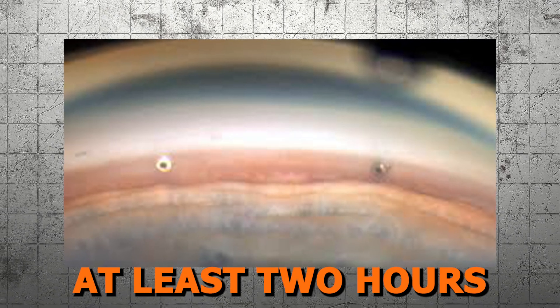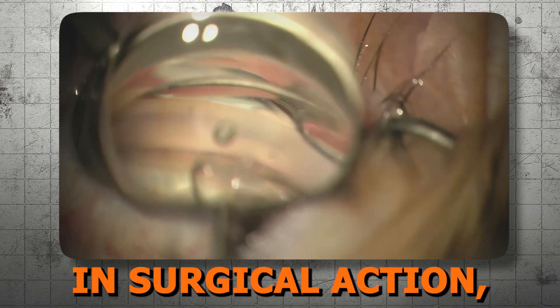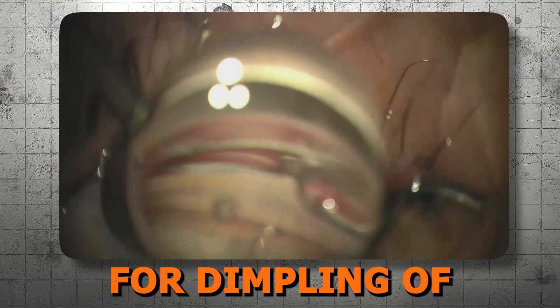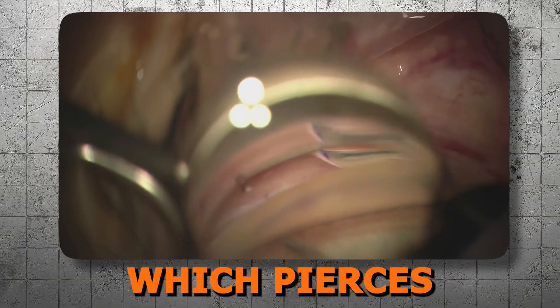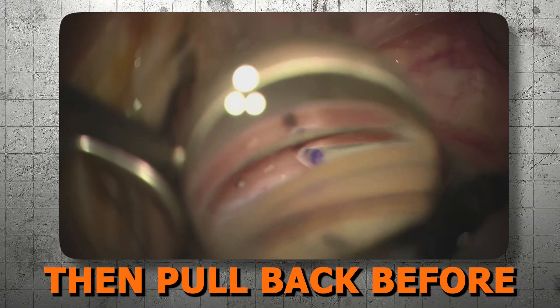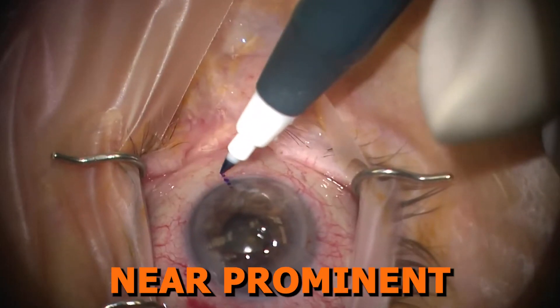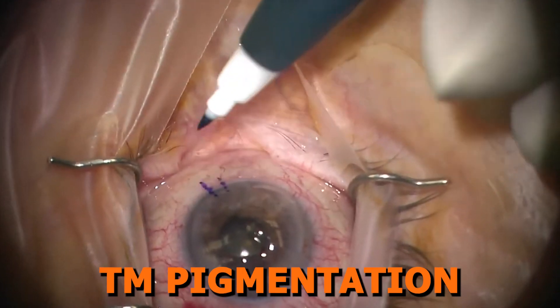With 2 stents in each inserter, placement at least 2 clock hours apart increases access to more collector channels. Here is the iStent Inject W in surgical action, where there is alignment of the trocar to the central TM, then a forward dimpling of the tip, followed by pressing the inserter button to release the device, which pierces through the TM into Schlemm's canal and is seated, then pull back before releasing the inserter button. In order to maximize the chance of outflow, targeting the insertion near a prominent episcleral vessel or increased TM pigmentation is also ideal.